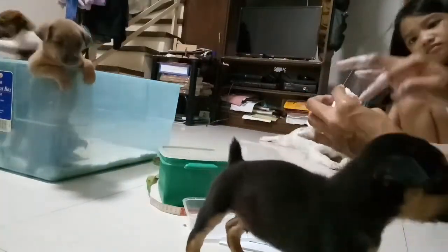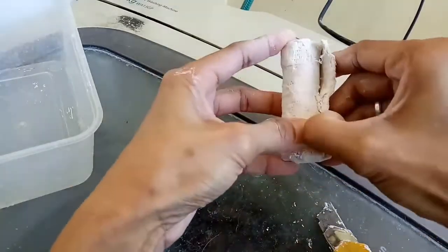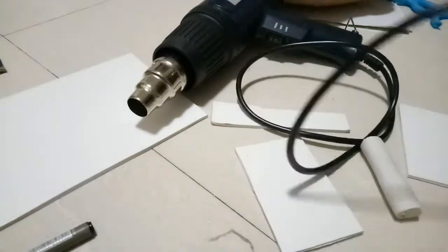Once the mold is done, I did a cast on this one. You can also check my other videos on how to make a live cast. Here it is — it's already dried up and I'm already removing the mold. And this is a Sintra board that I use, and this is the one we're going to use for his prosthetic leg.